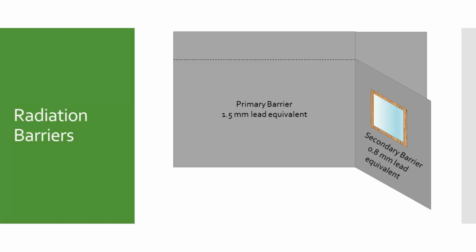If you are curious about the thickness of the glass in the window, typically 4 times the thickness of the glass is needed to be that of the lead. So if 1/32 of an inch is required for the lead, 4 times that would be 1/8 of an inch.